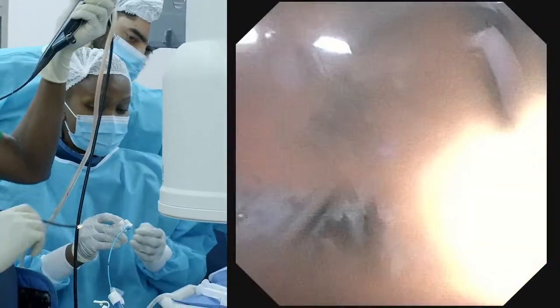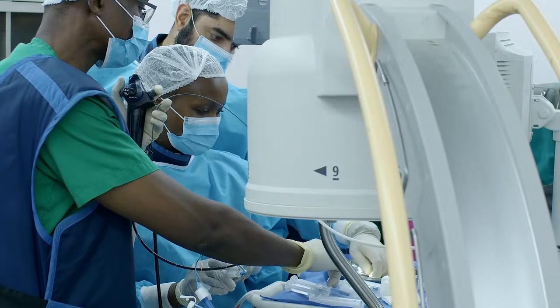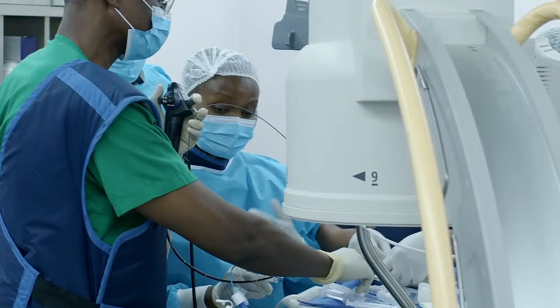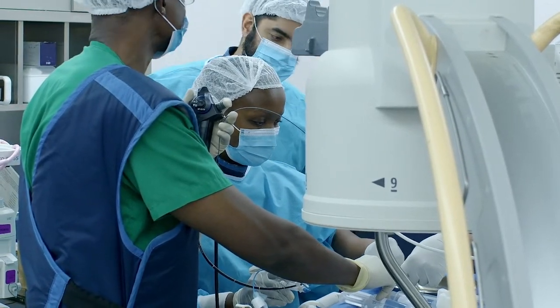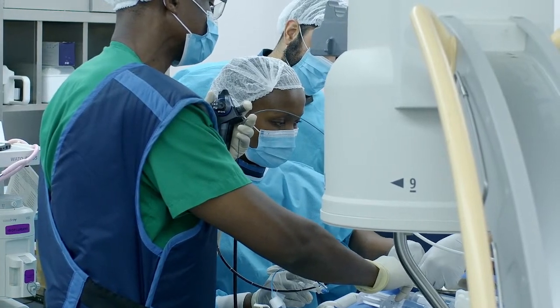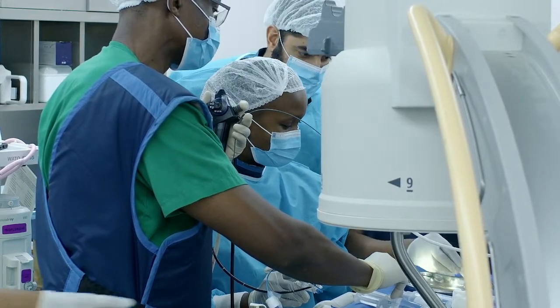Excellent. Jackie, you've got the balloon. Andrew, put it in here. Release the pedal. Good. Now, actually you can do it from your end. So you've taken the sample. Okay, I think we've got enough tissue there. I think just the thing of coordinating the. I hope you didn't toss out the. No, it's there. Okay. Good.